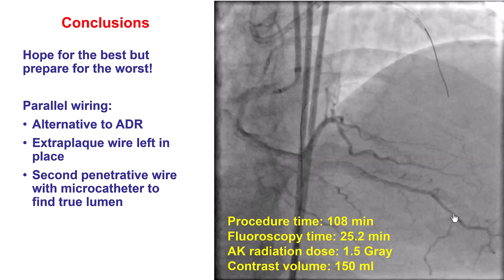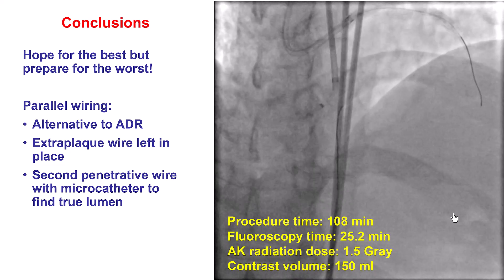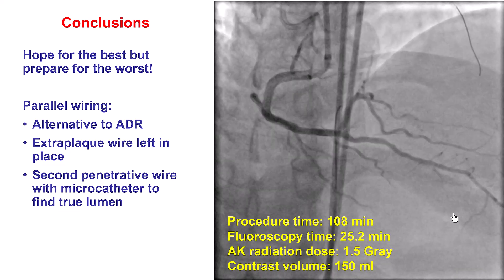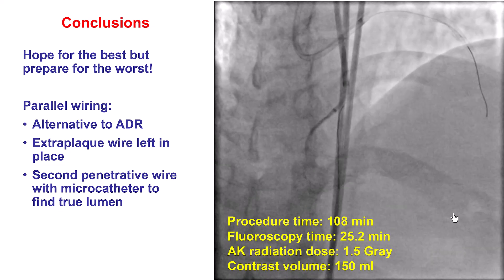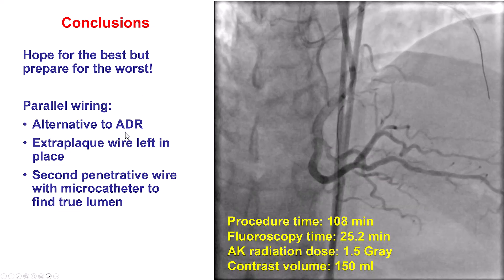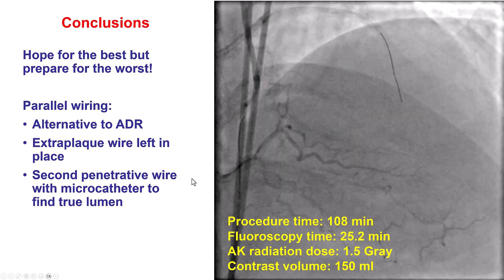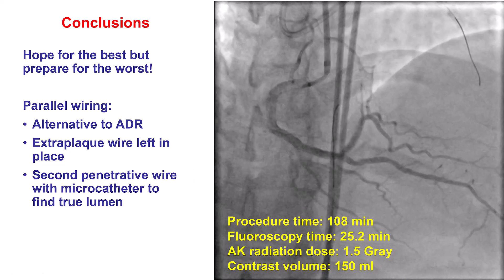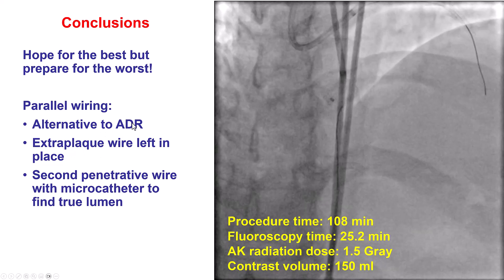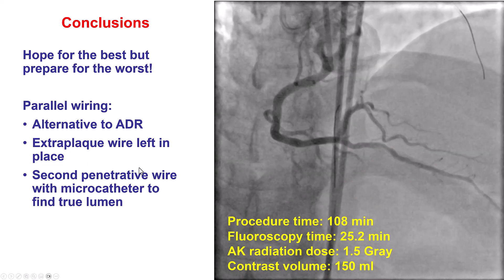In summary, this is a simple case but illustrates that although sometimes you may expect things to go very smoothly — in this case it seemed a fairly favorable CTO and the hope was that the wire would easily go into the distal true lumen — the wire instead went into the extraplaque position. You need to be prepared with options when this happens: either redirect the original wire, leave it in place and use the parallel wiring technique, or perform antegrade dissection reentry with a stingray balloon. In this case, we used the parallel wire technique, leaving the first wire in place and going with the second penetrative torqueable wire, the Gaia NEX2, which successfully crossed into the distal true lumen. This was less costly and easier than using antegrade dissection reentry. Redirection could have happened as well, but the polymer-jacketed wire may be more likely to cause dissection or hematoma.